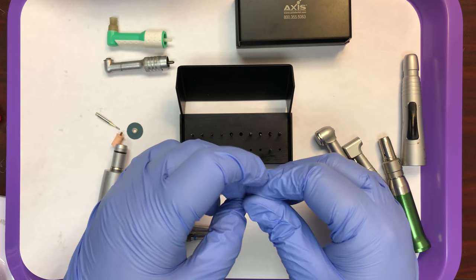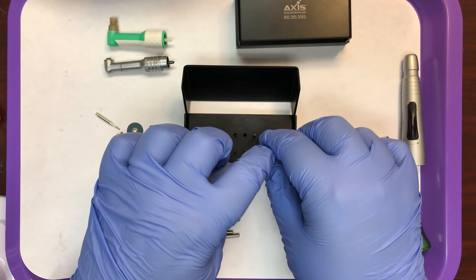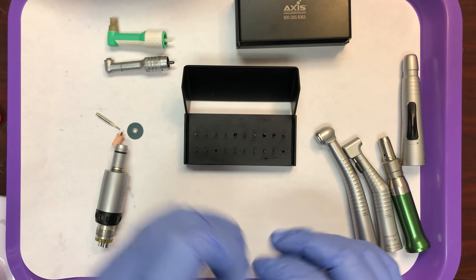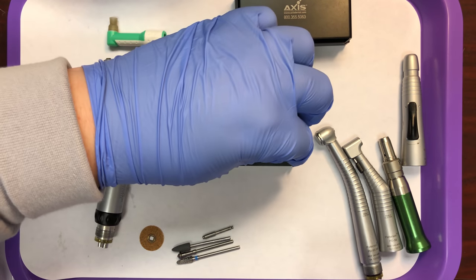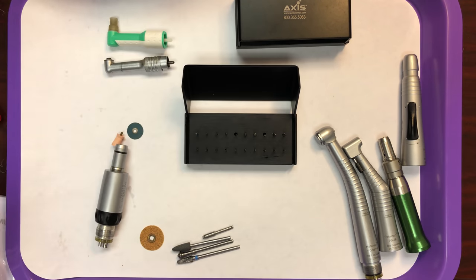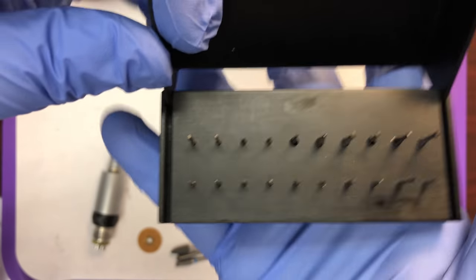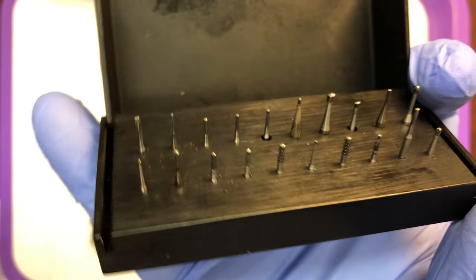I'm putting these back into the holder. In your office, you'll arrange these to suit your needs, but they get all mixed up here in class — and that's okay. It gives us good practice for memorizing these shapes.